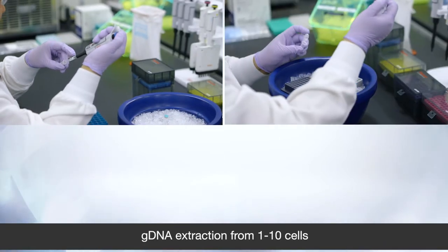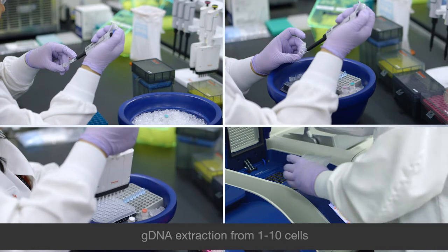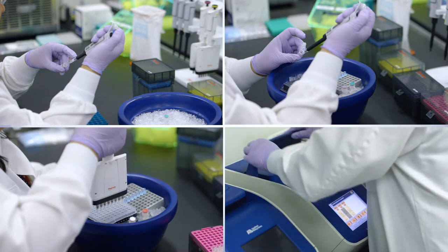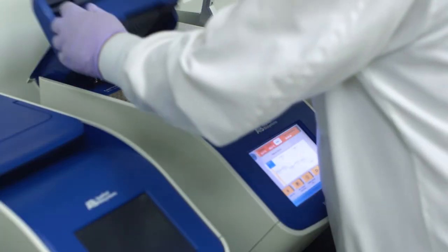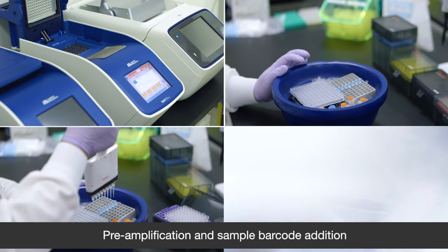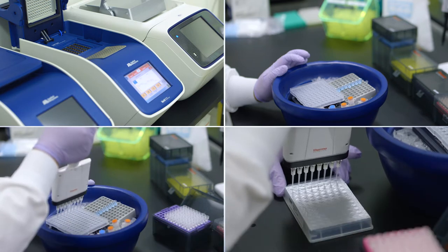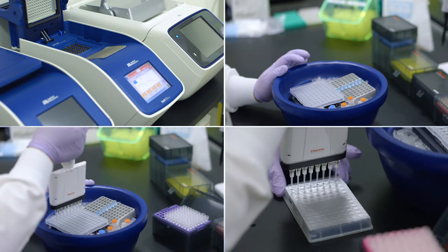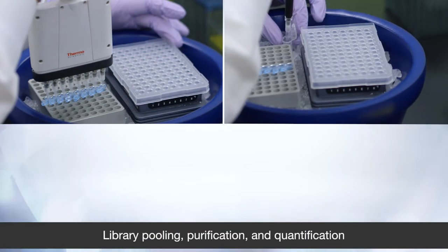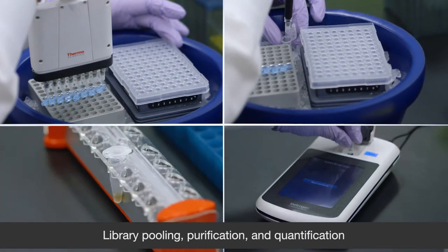First, you extract the gDNA starting from just 1 to 10 cells. Following a short incubation in the thermal cycler, the samples are preamplified and amplified and barcoded in the same reaction. Finally, the libraries are pooled, purified, and then quantified.